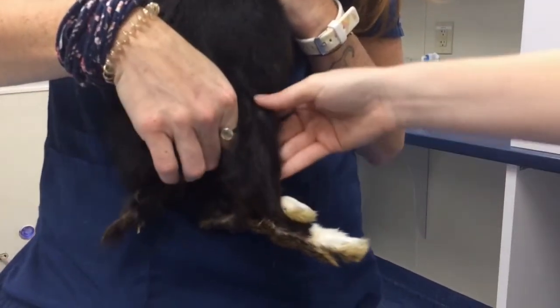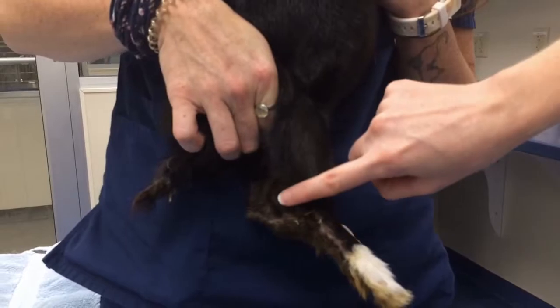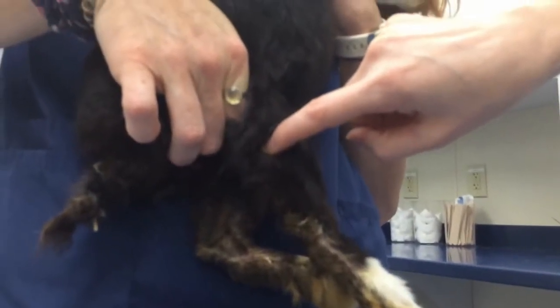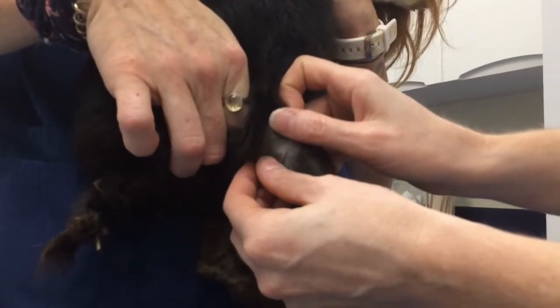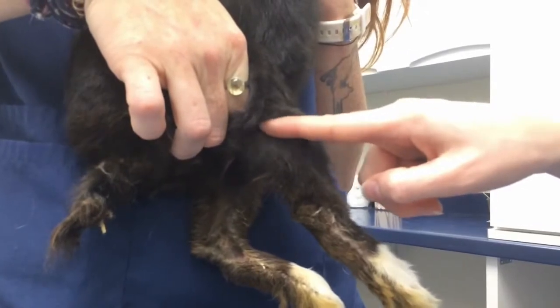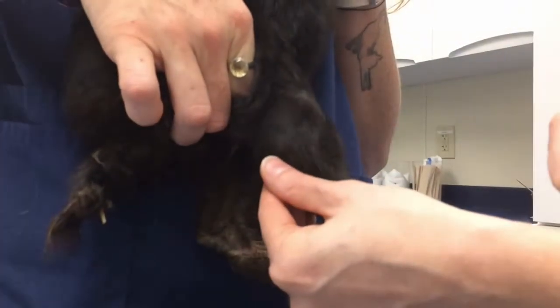She's holding off above the knee. For rabbits in general, their vessels — I always recommend feeling for them first. I can feel the vessel right here. They are placed differently than where a dog or a cat would be. The vessel runs right along here along the back of the leg, and then it branches over here. It is more caudal and dorsal than you expect that vessel to be. In this position, you can use a needle to go ahead and do a blood draw from this direction.